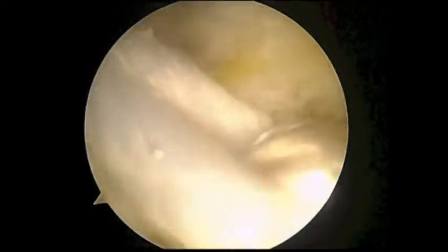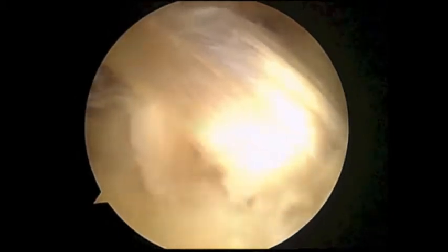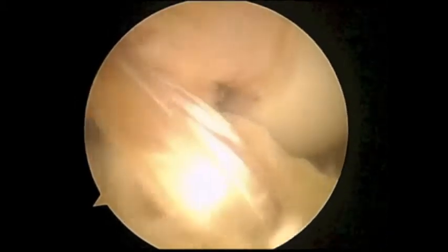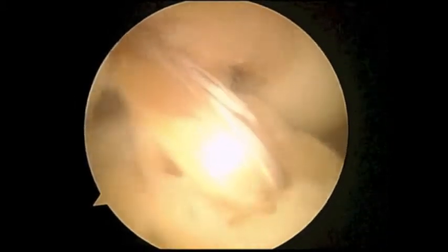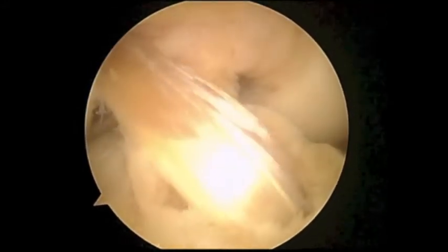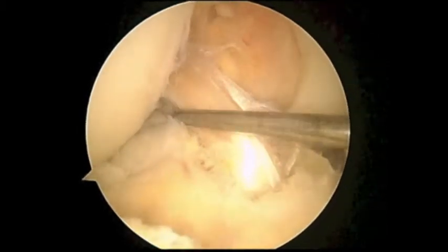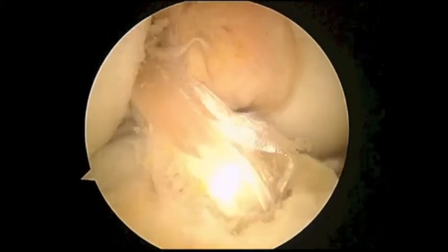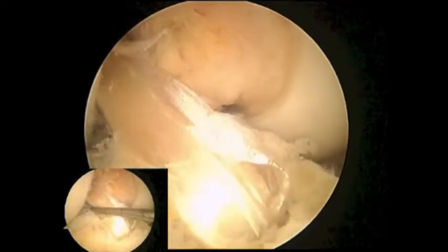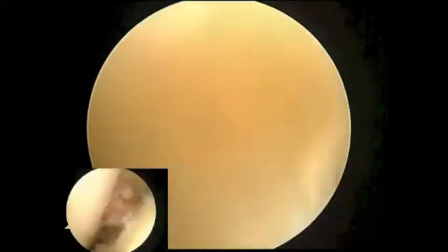I'm going to use these sutures to shuttle our graft through our tibial and femoral tunnels. Once the graft is securely docked, it's going to be fixed at both ends. This will hold the graft in place while it heals. I'm going to test the graft with a probe to make sure it's nice and tight, that there's no laxity in that graft. And then we'll take that knee through a range of motion to ensure there's no impingement, that the knee gets to full extension and full flexion. There will be no stiffness for this patient postoperatively.